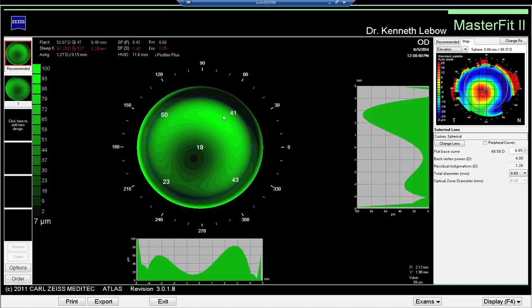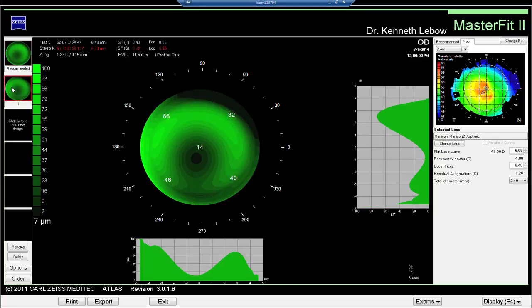A red spot on an elevation map is going to cause touch on a fluorescein pattern, while a depression on the elevation map — the whole area in blue, below the reference sphere — is going to create a great deal more pooling. There's a tremendous amount of pooling surrounding the area of apical touch. We're using a spherical base curve to fit a very aspheric cornea, because keratoconic eyes have a higher eccentricity than the normal spherical cornea. In this case, we tried a custom spherical fit and wound up with an aspheric lens design showing a little bit of touch but lower levels of clearance.